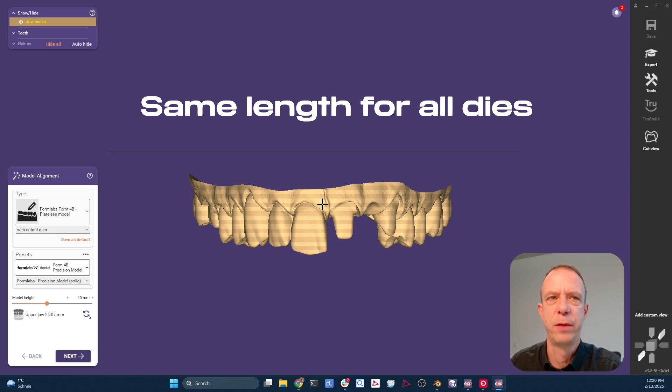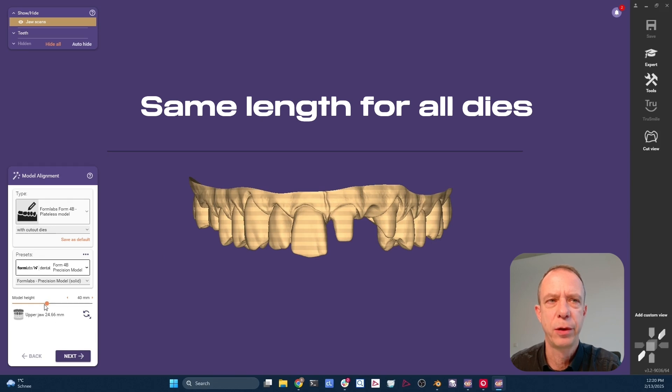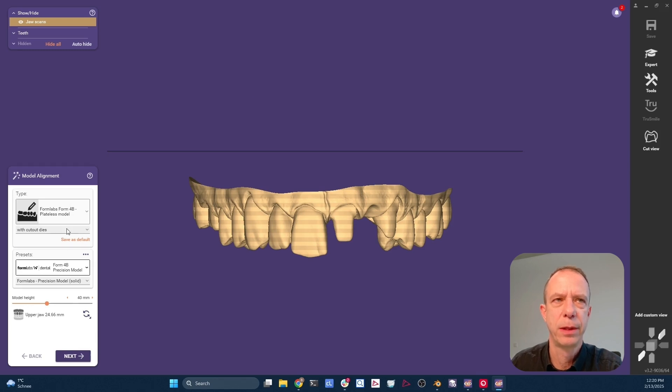That's why I tilted it a little bit, because otherwise the canine would be super short. That's a thing to avoid. And then I also pulled it a little bit down. As a general rule of thumb, I recommend to end up here with a value around 24 to 25 millimeters. So once we are done with this, we can click next.